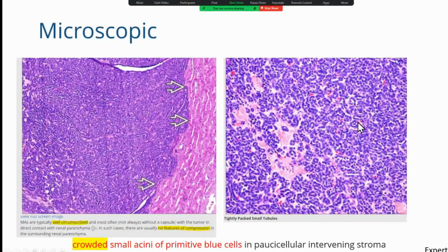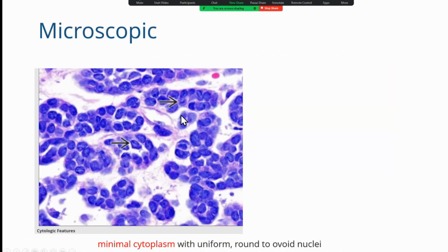And then again, these tumor cells form really compact acini of primitive tubules. And this is the nucleus feature. We can clearly see these cells are not perfectly round when you compare them to the neuroendocrine tumor cells. Some of the cells show a little bit of nuclear molding with each other, and they have minimal cytoplasm.